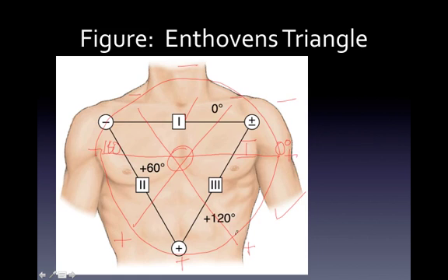Okay, so that means that this would be 90 degrees. And lead 2 is about 60 degrees. Lead 3's positive electrode is about 120 degrees. So the question is, do you understand where I'm coming up with this numbering? It's because of the way that the 12 lead looks at the heart.